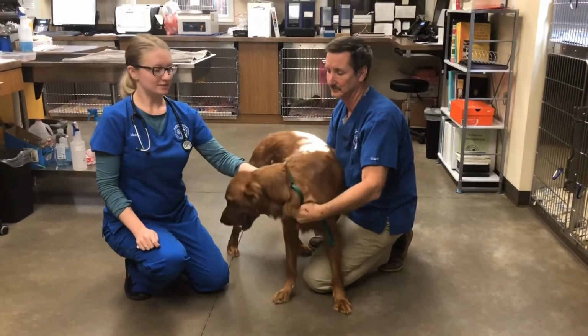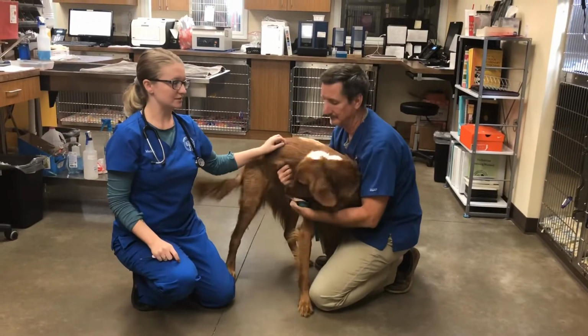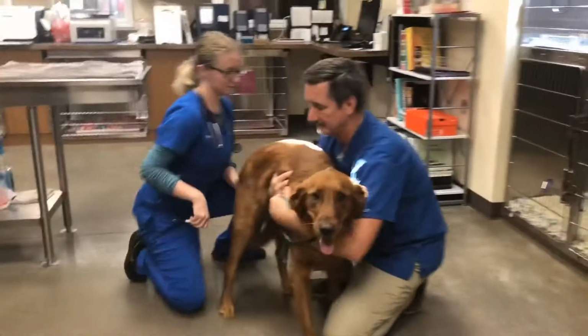Okay, now I will be demonstrating a physical exam on a canine patient to ensure that they're ready for anesthesia. To do this, I'll start by obtaining a TPR, which is temp, pulse, respiratory rate. I have a loop thermometer here, so I'll start by getting his temperature.